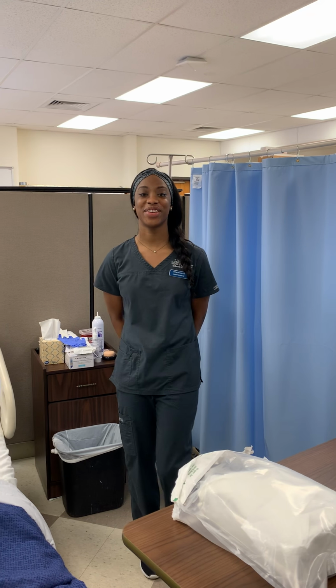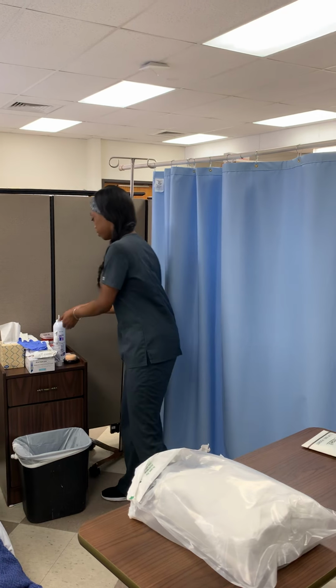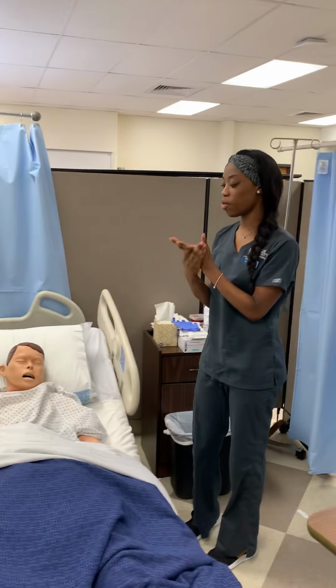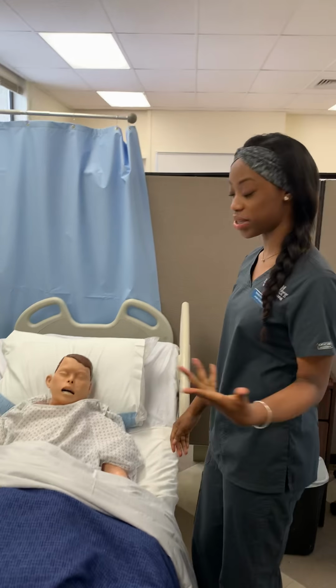Hello, my name is Sydney Sears, and I'll be showing you how to insert and remove a Foley catheter on a male patient. Before I do that, I will perform hand hygiene, make sure privacy is available, and also get two patient identifiers from the patient after I introduce myself.